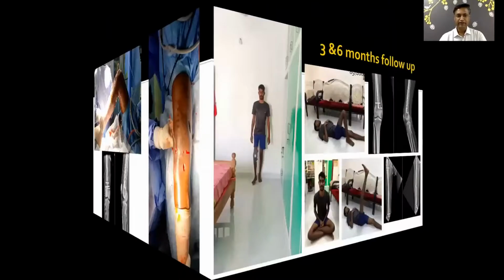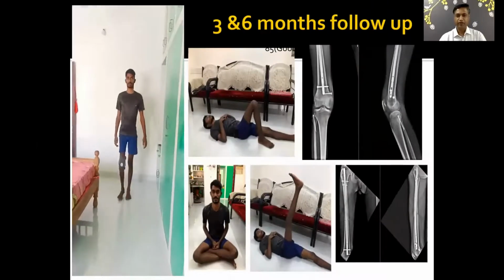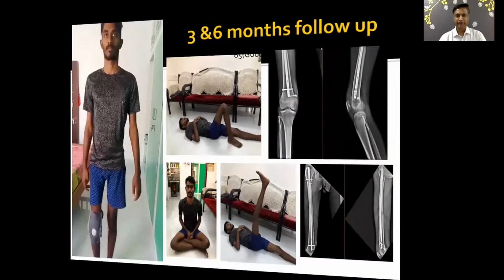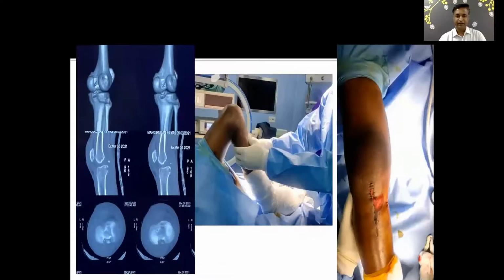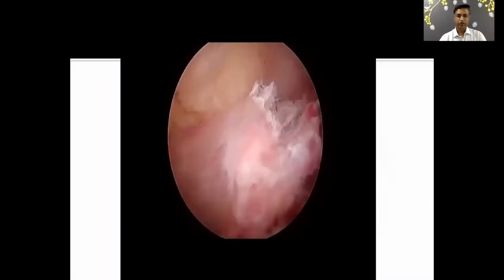So this is a patient at 3 months follow-up, and now his fracture is healing well and he is having an excellent outcome. So this is a similar patient, tibia fracture, also had a tibial PCL avulsion injury. So after fixing the tibia, we were able to identify gross anteroposterior instability. So we decided to do a scopy for him. So he had a similar pattern of injury.